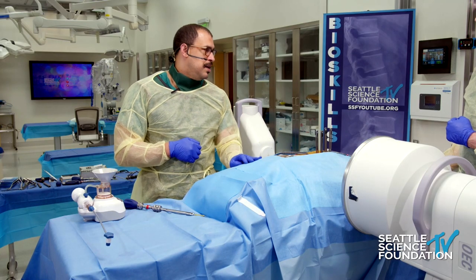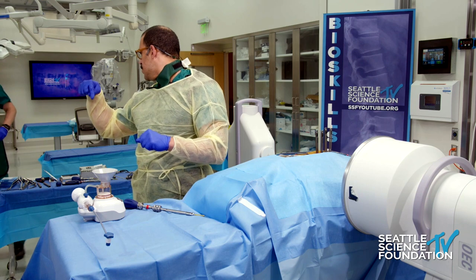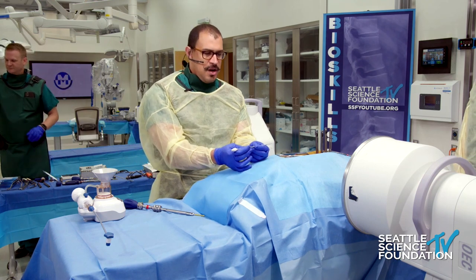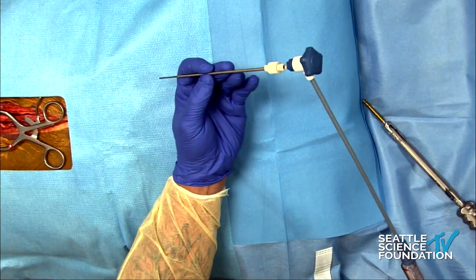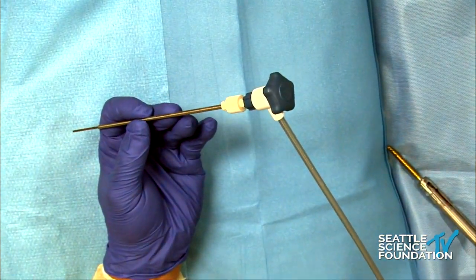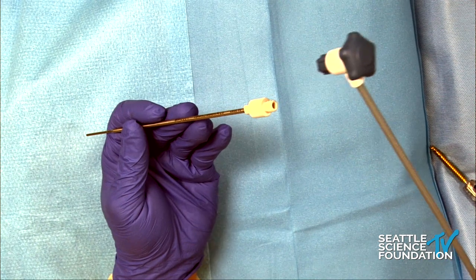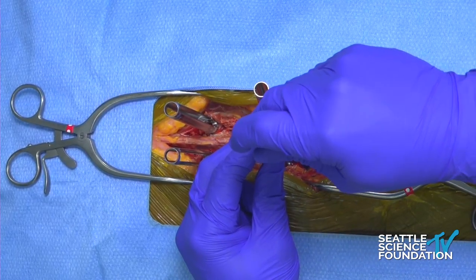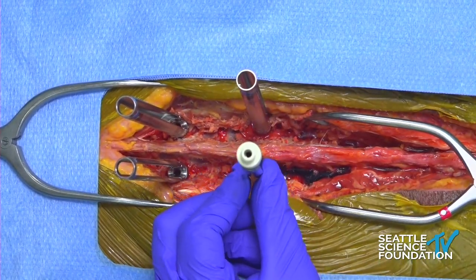So we'll just give it just a second. The inserter actually goes into the tube — this will attach to this piece, and we want to get that cement directly into the screw itself. Making sure that you have a very firm attachment to the actual screw so you're not getting the screw coming back out and extravasating. This fits directly down into the percutaneous screw system, but this works for open as well. This needs to go all the way down into the screw so that you're getting your cement applied directly down into it.